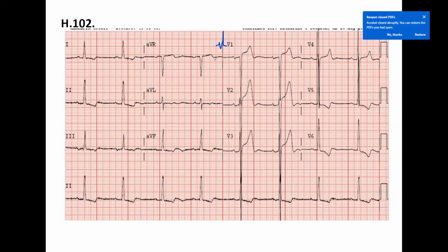But if it's wide, for sure you have right or left bundle branch block, a complete one, as we said. Okay, but there is no... in this situation. Go on. I can see next in V1, V2, and V3, still inside the QRS, a very deep S wave. Okay, that's okay.